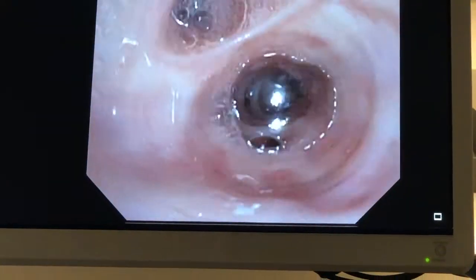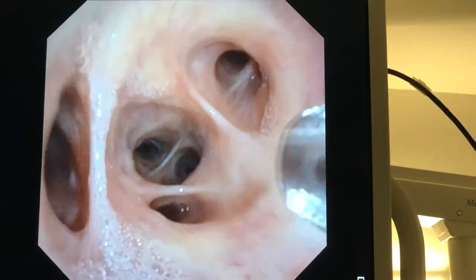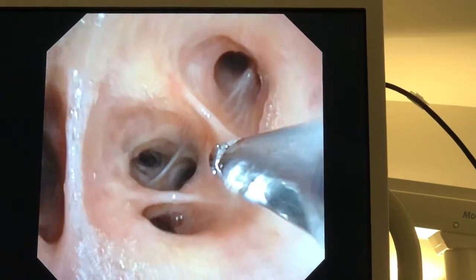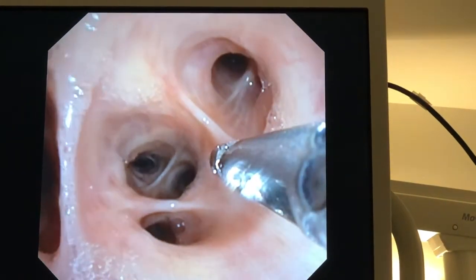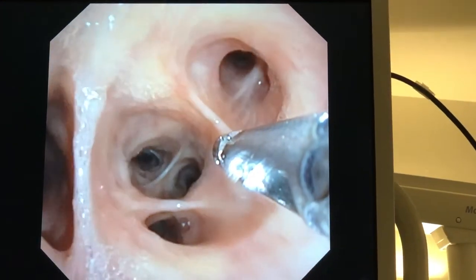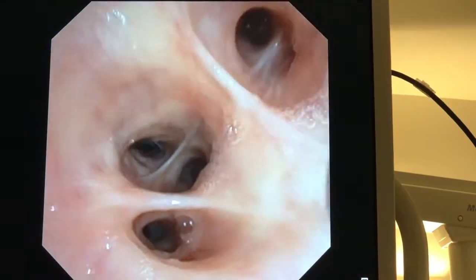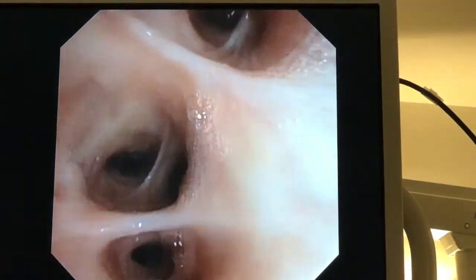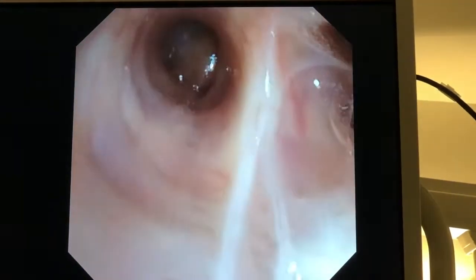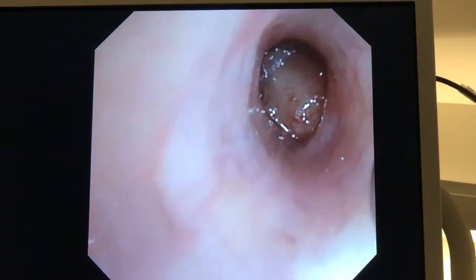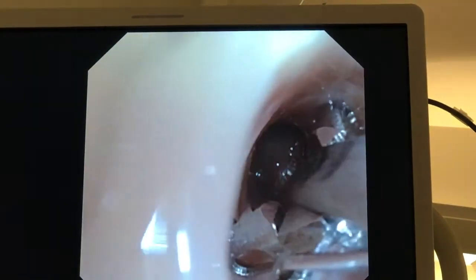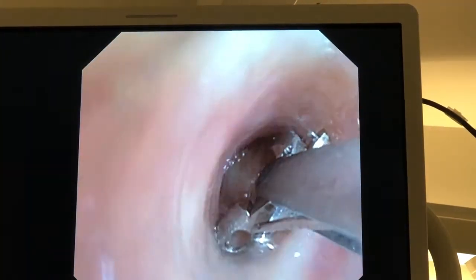So you can see there's an endobronchial lesion in that apical segment of the right lower lobe which we can target for endobronchial biopsy. So here we are with the biopsy forceps. We're just going to relocate that endobronchial lesion and take some biopsies to get a lot of tissue for ancillary testing as well as diagnostics.